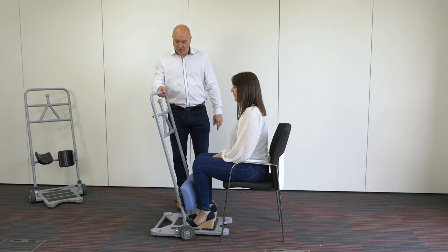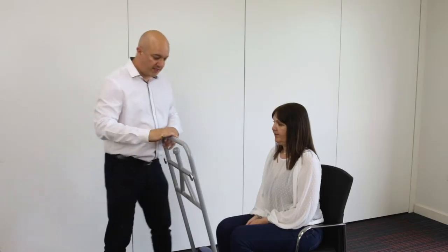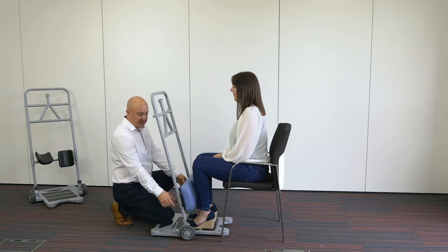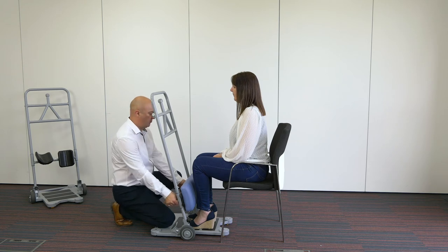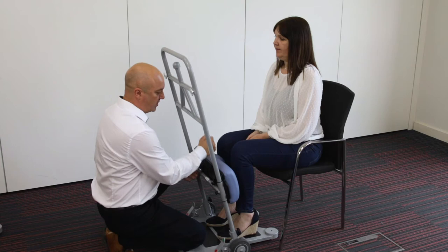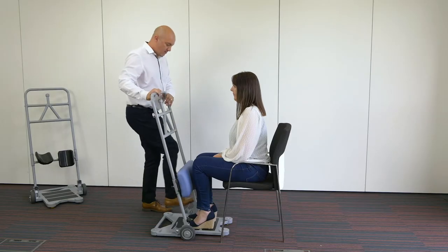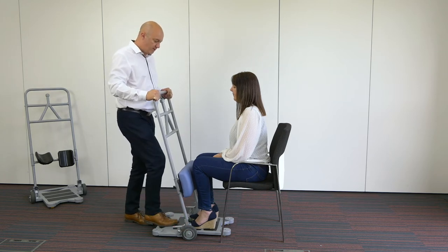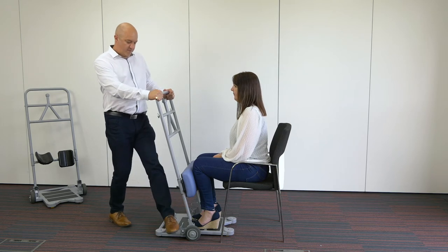I'm going to stop just short of the shins because I can see straight away that this knee pad is a little bit too low. So I'm going to pop the brakes on, get down and adjust it by pulling the two little pins out from the back, raising it up slightly — just below the knee. Brakes off, bring it in closer to the shins, then lock the brakes on again.